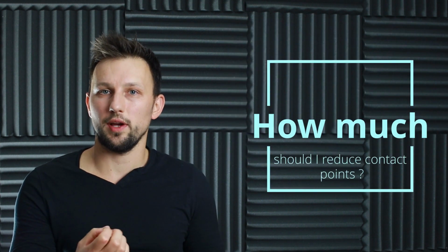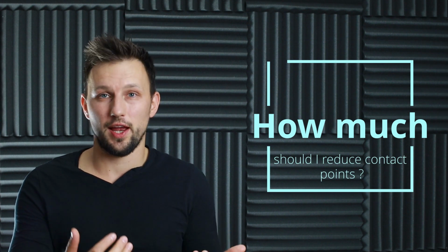But right now there is a question. How much should I reduce the contact point? And how can I judge whether the contact point is okay or not? Because let's be honest, a strong contact point is one of the aims of the final crown. On the other hand, when we've got a strong contact point, there is a risk that the crown will not be stable or we will not reach the final position.